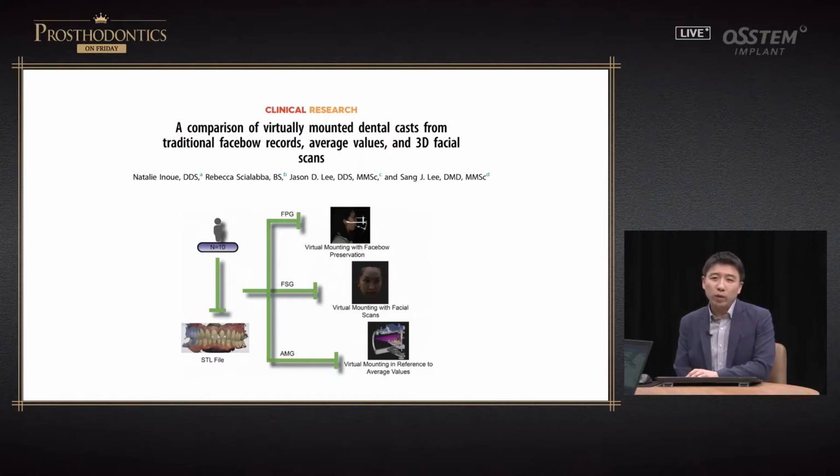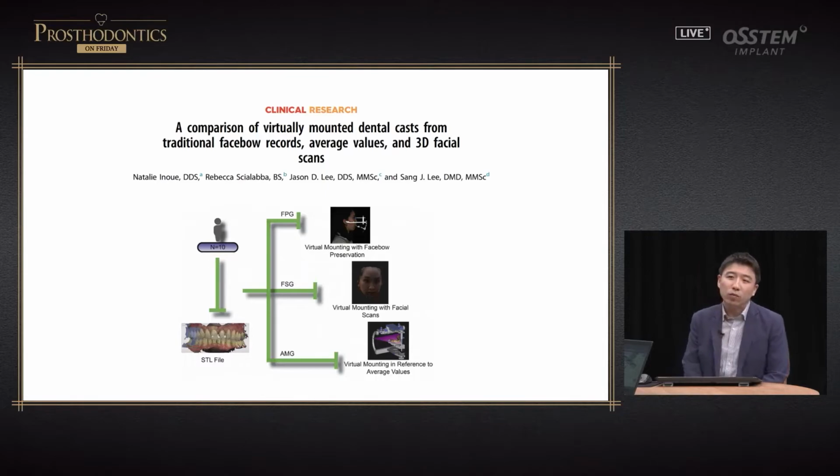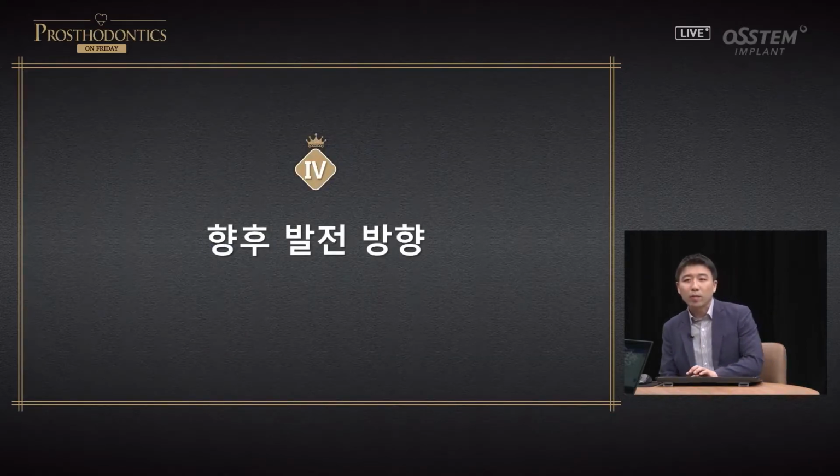These days, it's a very early stage, but you can use facial scan to do digital mounting. Clinical studies are being done in this end. If you look at what's been reported, compared with the traditional face bow, statistically, it doesn't really fall behind, and I believe this can be utilized significantly.